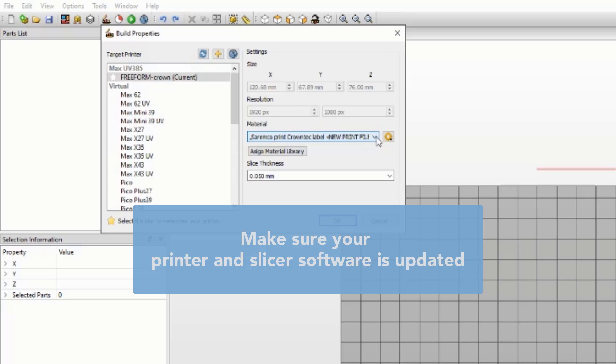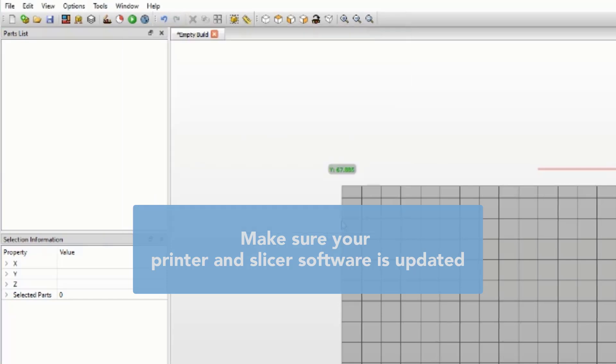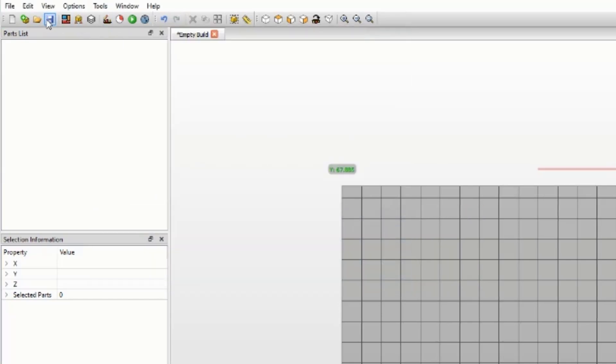Make sure that the slicer software and printer is updated. Select the right print profile or parameter of your specific printer.